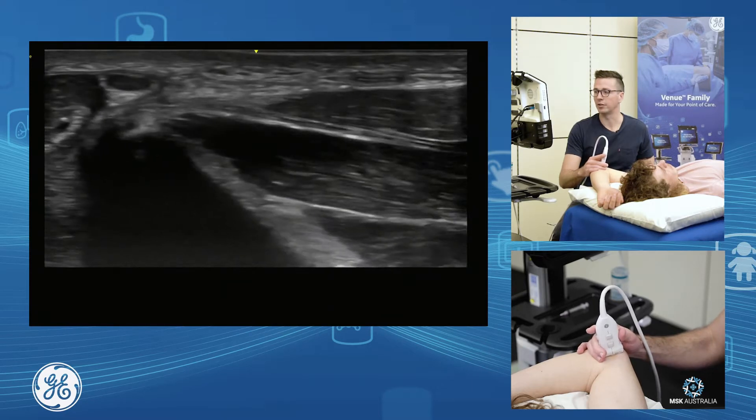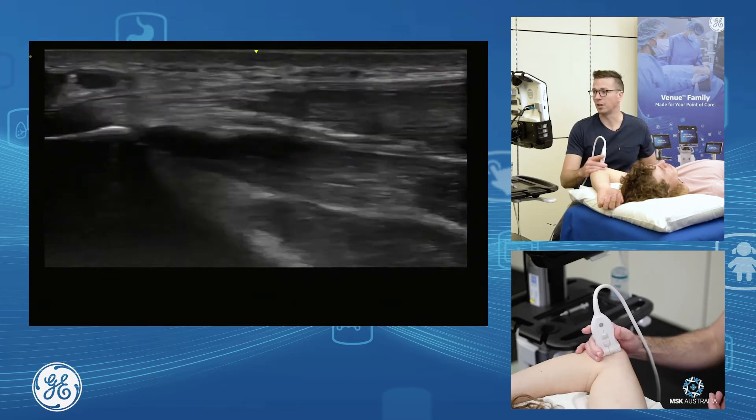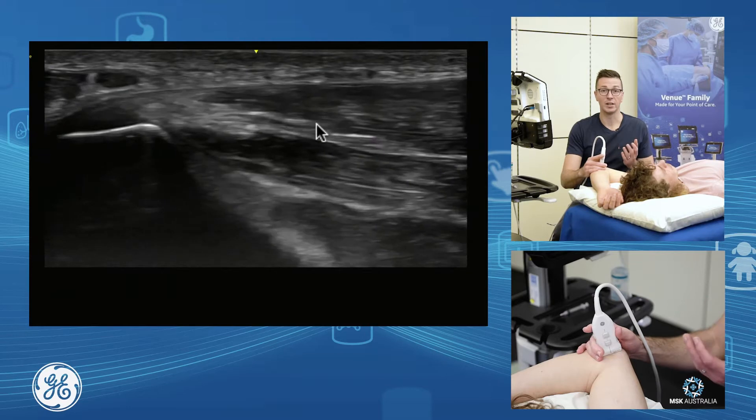Now I fan through that enthesis, so I can do enthesis assessment, proximal tendon assessment, and I can assess the proximal musculotendinous junction. There's our common flexor.